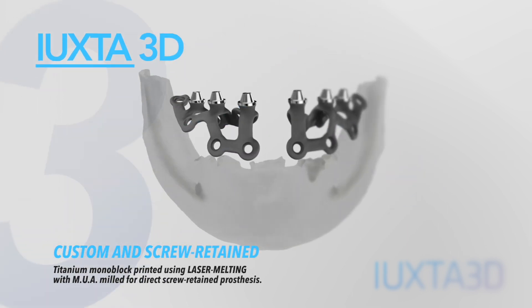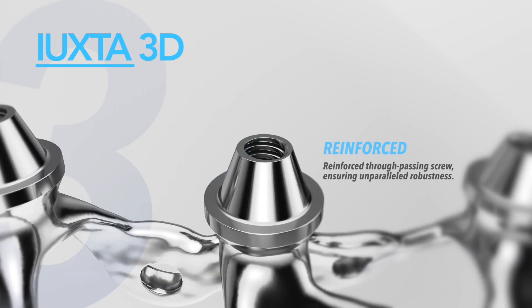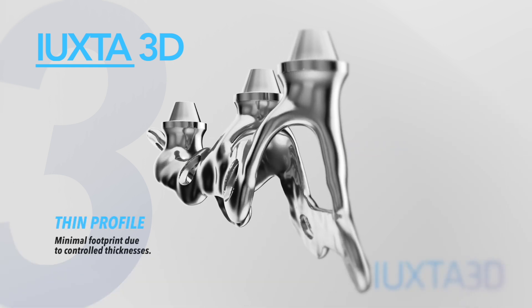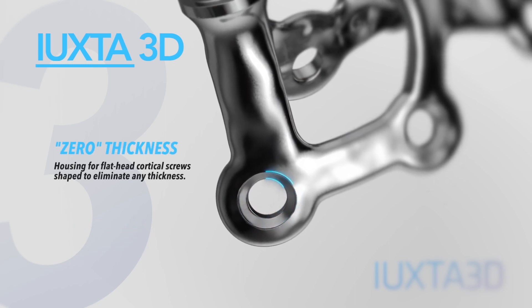Uxta 3D is a 3D-printed titanium monoblock, milled at the MUA locations, with various surface customization options. It is extremely robust, yet has a thin and lightweight structure. The location for cortical screws is specially designed to eliminate their protrusion.